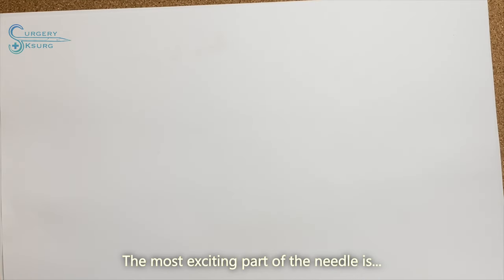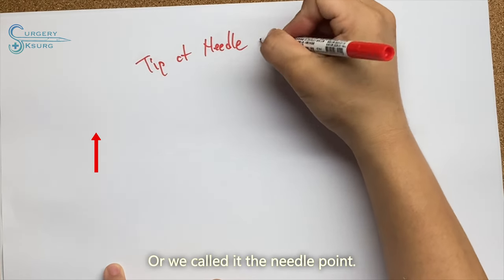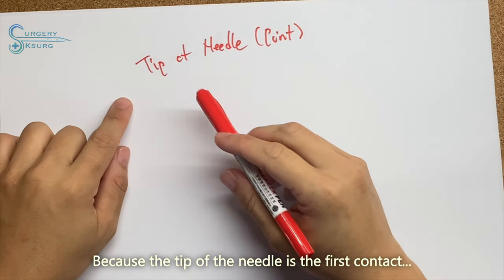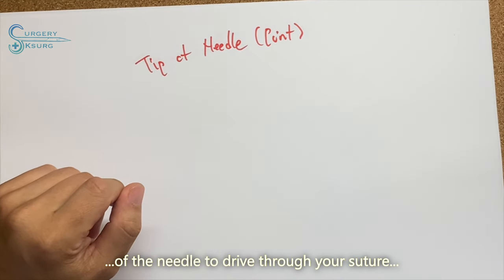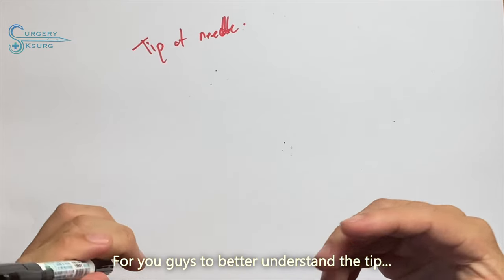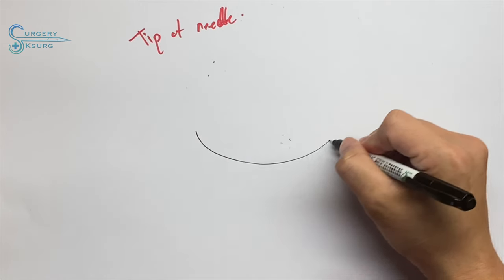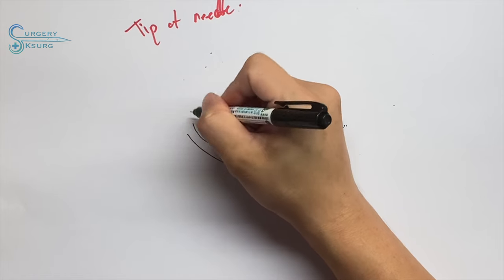So the most exciting part of the needle is always the tip of the needle, or we call it the needle point. Why is it important? Because the tip of the needle is the first contact of the needle to drive your suture into the tissue that you are going to put the thread on. So for you to better understand, you can see the needle has a body, but we focus on the tip.